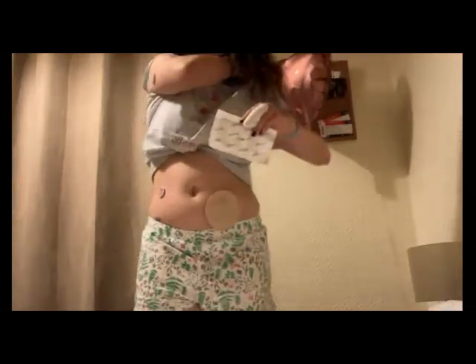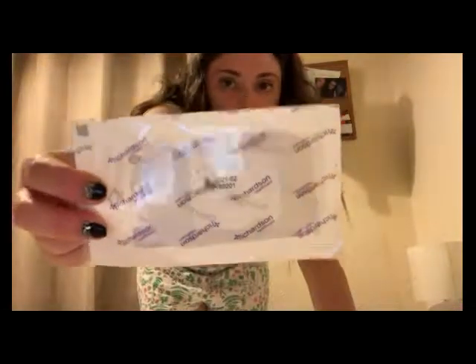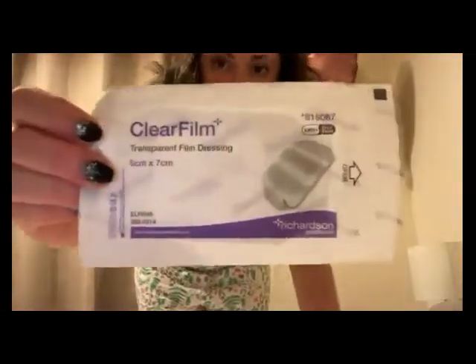Right, I probably have told you in the past, I use clear film dressings to go over the top of my sensor so it doesn't come off, because when you have it on your tummy there's more water reflecting on there, because I have a shower, I don't have a bath, so I don't know what it's like in a bath. I know when I go swimming it's pretty good, and I go swimming quite a lot when I'm well.